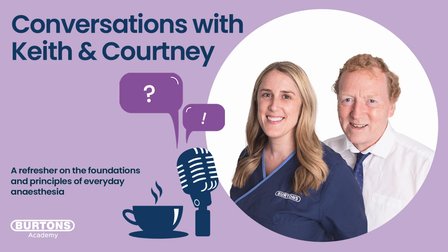So the stroke volume is affected. With your bleeding animal, your stroke volume is unlikely to be affected until it gets profoundly hypovolemic. So that's not going to be a trigger or an indicator of a bleed. You see other effects before you would see the capnography effect.